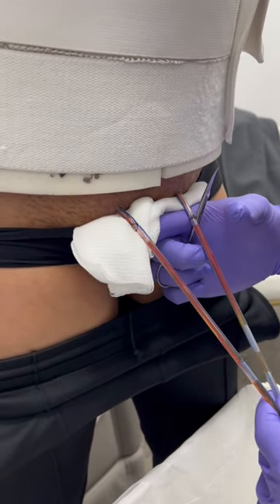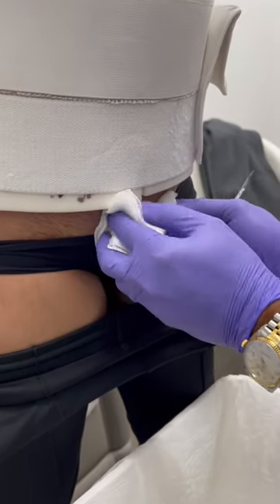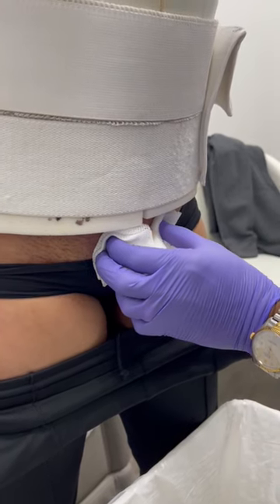Okay, we're going to do it on three — one, two, three. We're going to hold this gauze here with a little pressure, and these little drain holes will close in about two to three days.